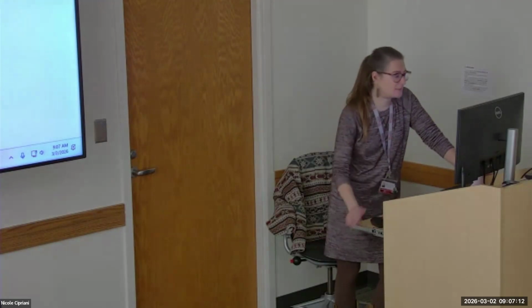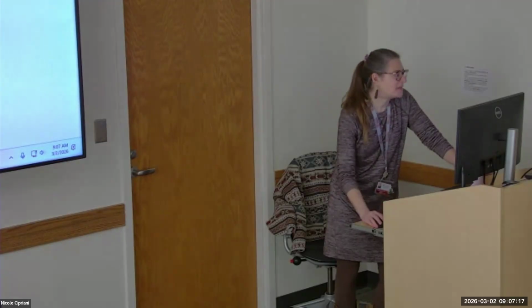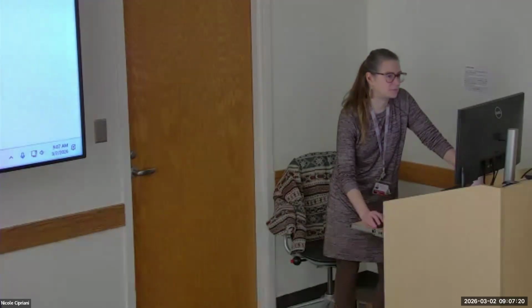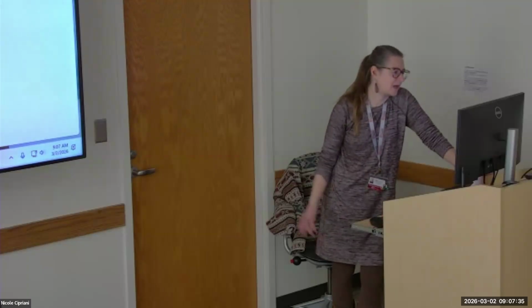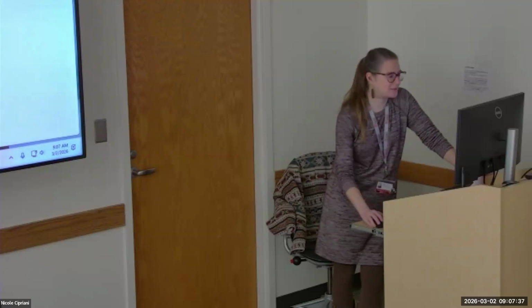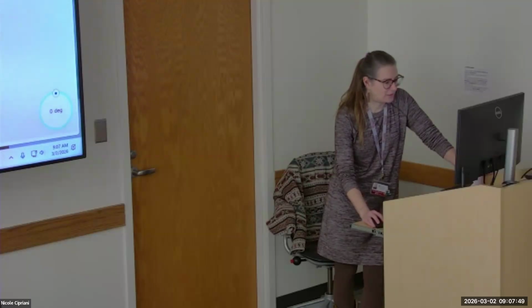Anyway, did you guys look at that core biopsy and what did you think? Basal cell adenoma. Why did you think that? Because the cells were basaloid and it had that jigsaw appearance at low power. That's my fault. I think this might be a lost cause. I can send you guys the answers. Yes, that was a basal cell adenoma with S100 positive stroma in the background and beta-catenin expression.